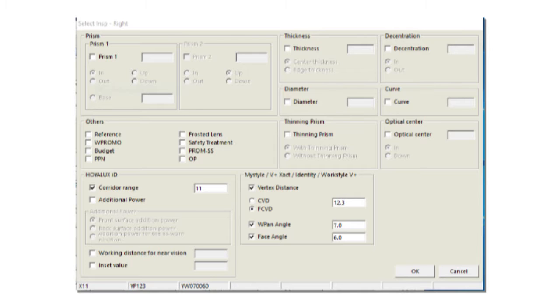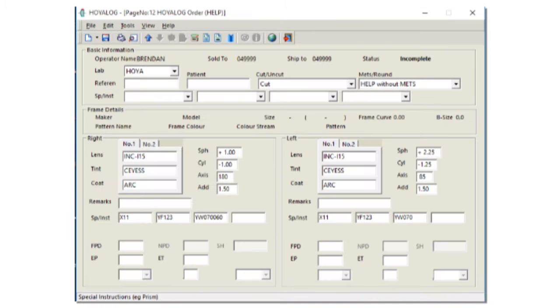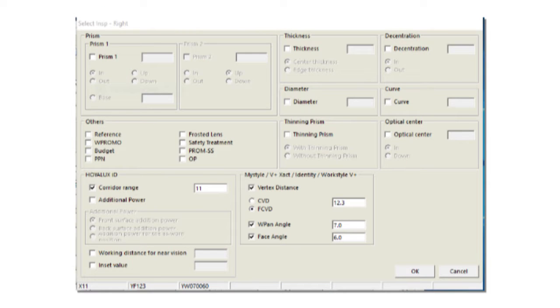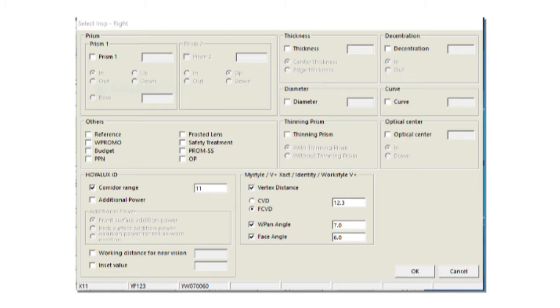Below that, we'll input the wearer's pantoscopic angle, the value to the right and lastly, the face angle, which is the frame face form angle as measured with a protractor. We are going to mimic the special instructions of the right eye to the same with the left eye. So on the left hand side page, you'll see it looks very familiar. Again, corridor range with the value to the right. Vertex distance, we again choose the frame corneal vertex distance and the value and then the wearer's pantoscopic angle to the right. There is no frame face form angle on this page as we only have to input it on the right hand side.